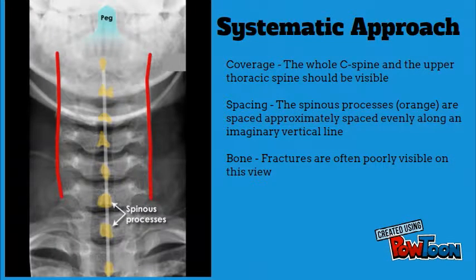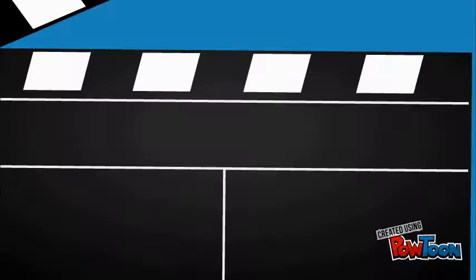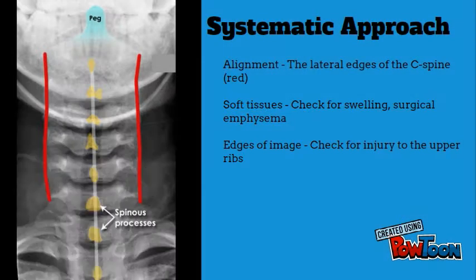Check that the coverage is adequate. Look at the spacing between the spinous processes, and then look at the bone — note that fractures are often poorly seen in this view. Check the alignment, the soft tissues, and the edges of the image.